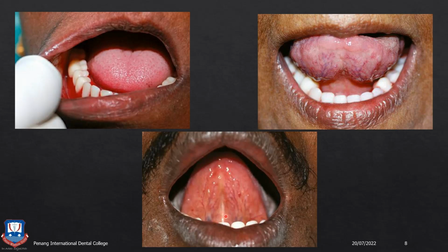You have to check the lingual frenum relief, especially here in the Penang area, as what I have seen in the past 2 months is that most of the patients have very high frenum attachment, or something similar to a tongue tie. So you have to give extensive lingual frenum relief for the stability of the denture.